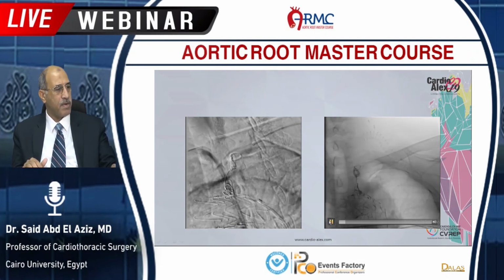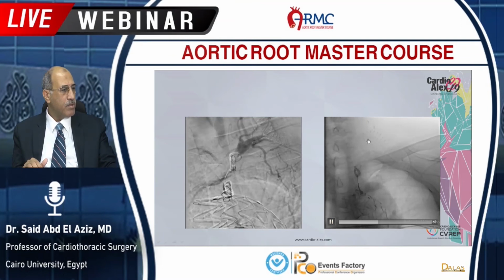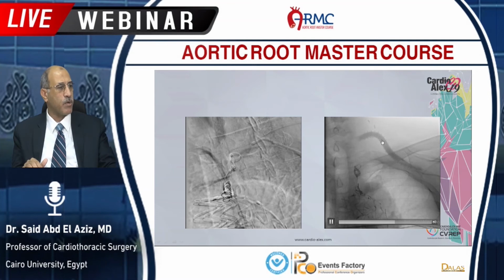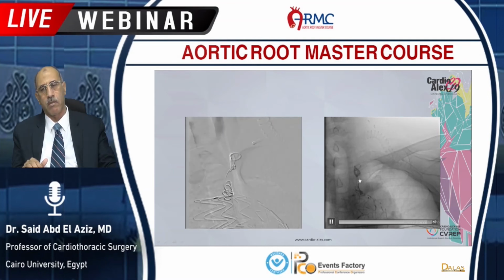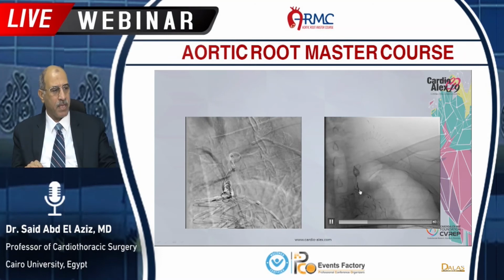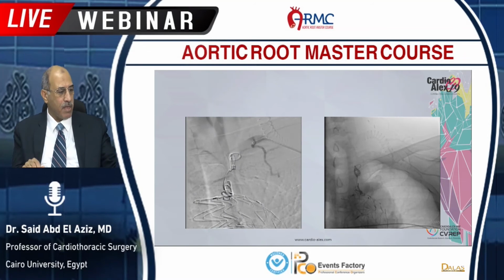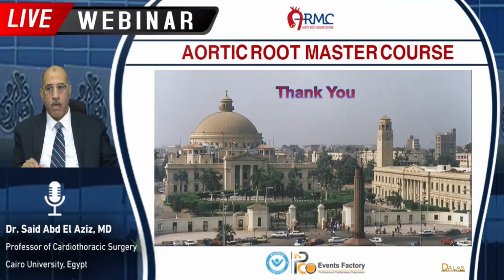And this is another picture. You see that this is the carotid subclavian bypass, and these are the coils that we used to occlude the subclavian artery at 2 levels, a level at the stent and a level in the mid artery at the entry tear of the dissection flap in the subclavian artery. These are small videos for you, and I hope that you enjoyed this presentation.